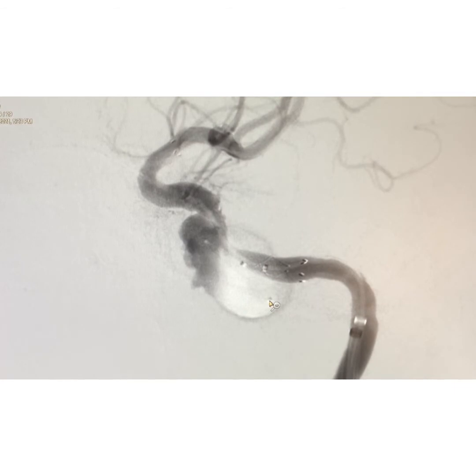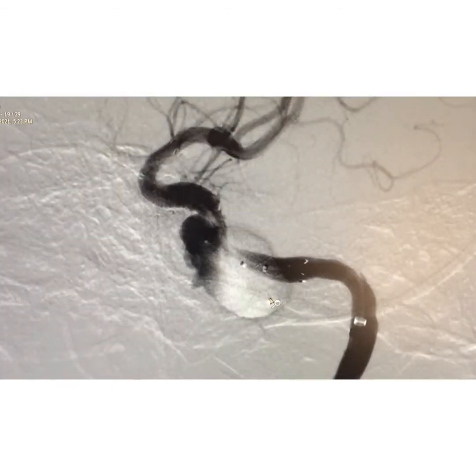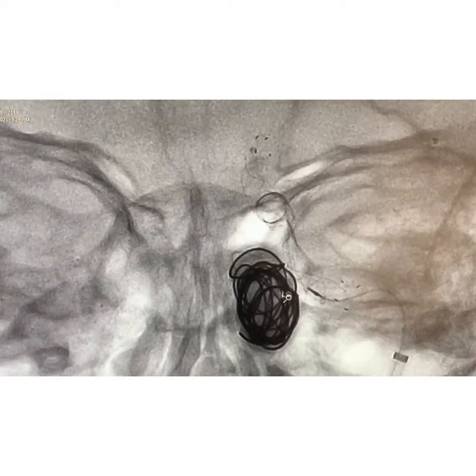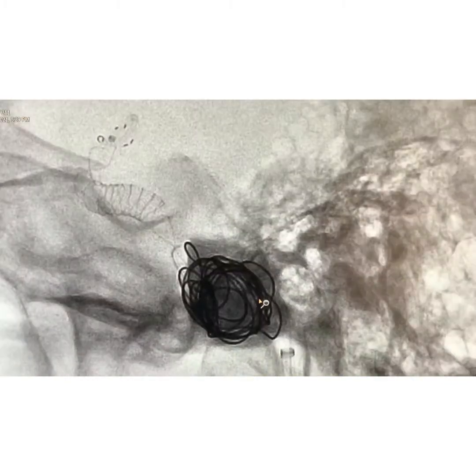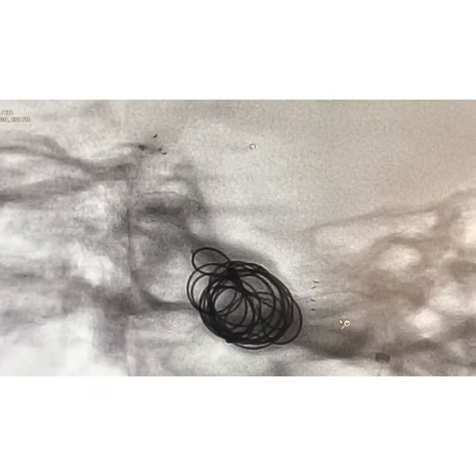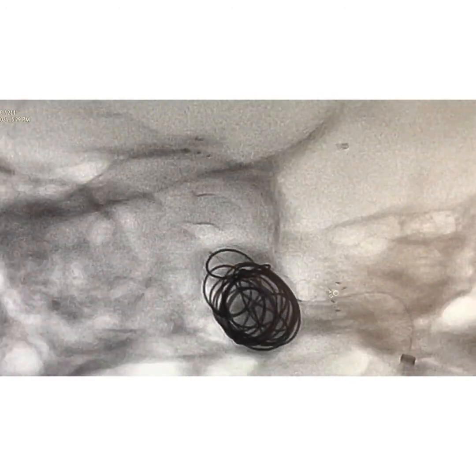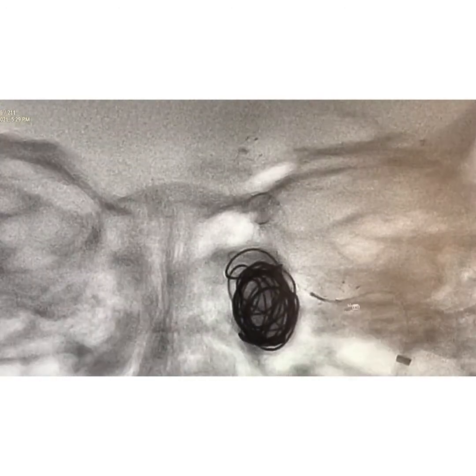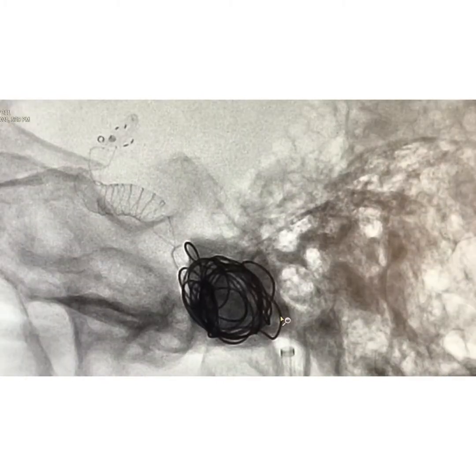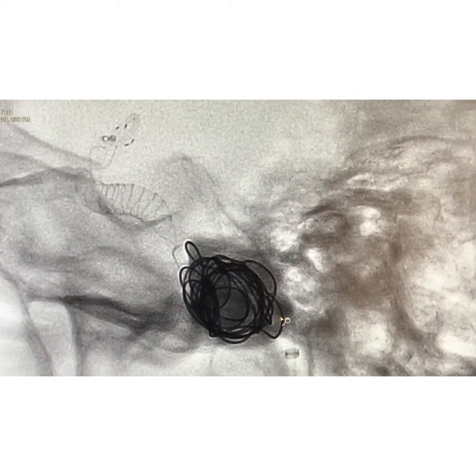We have a coiling catheter tip over here, which we have put here, and so we will just put some coils, loosely coil this aneurysm and come out. So we have just put enough coils to make it look a little comfortable. You need not really pack it because you have a flow diverter across the neck of the aneurysm. No need to pack. You just have to rotate and see that the neck is well covered with the flow diverter. Everything looks good, and this aneurysm has enough coil for the rapid thrombosis.